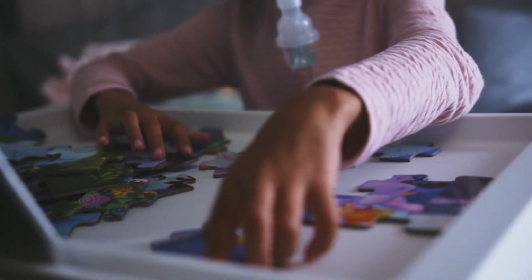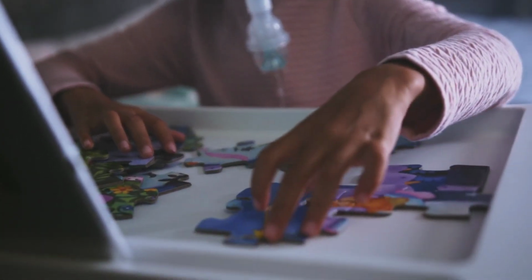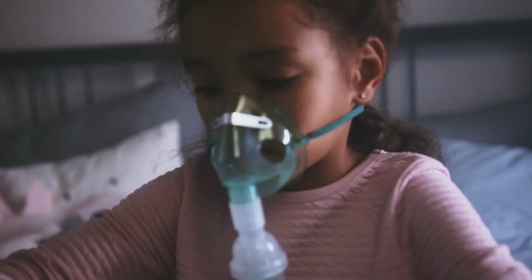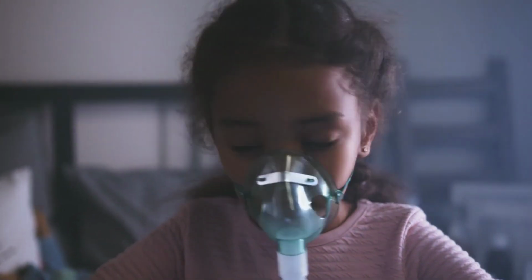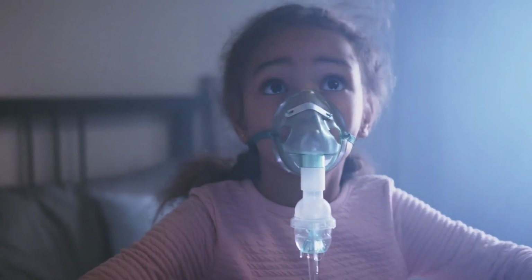Nebulizers are typically used in cases such as asthma attacks, delivering quick relief medication to open airways; chronic conditions, for routine management of COPD or cystic fibrosis; severe allergic reactions, providing emergency treatment during airway constriction; and infections, administering antibiotics directly to the lungs.